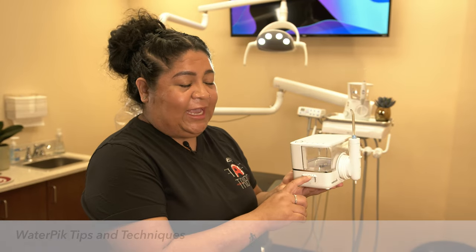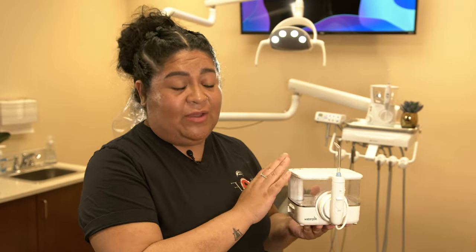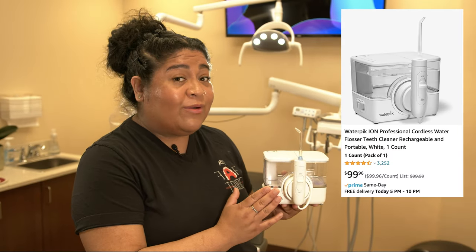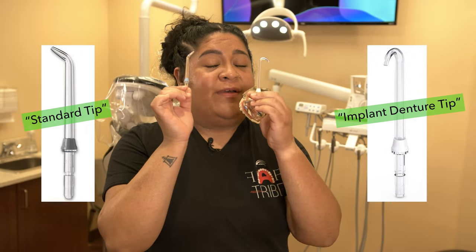Once brushing is done, follow up with your Waterpik. For the Waterpik, feel free to get any over-the-counter model as long as it has actual settings — you do not want one that just has low, medium, and high with nothing in between. You want settings so you can work your way up to higher levels. This particular Waterpik is the Ion, one of our favorites. Make sure you're using two tips: your standard tip and your hook tip. Most Waterpiks come with five or seven tips — ignore the rest.